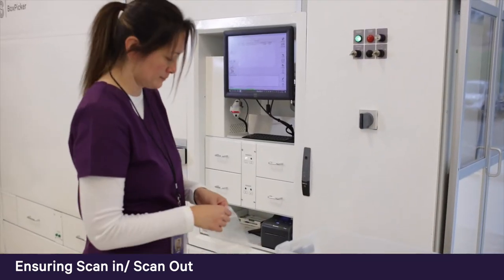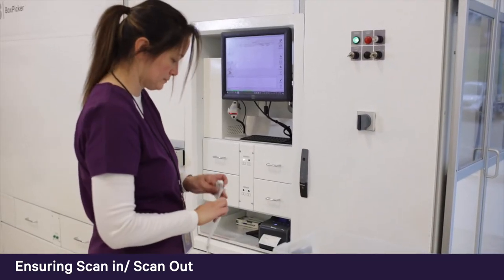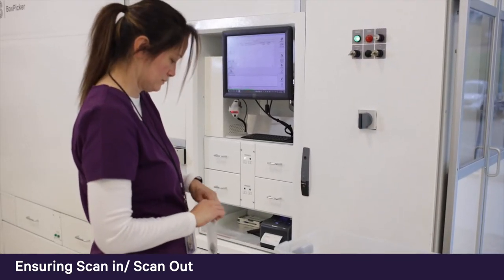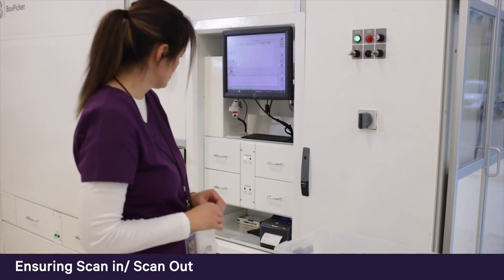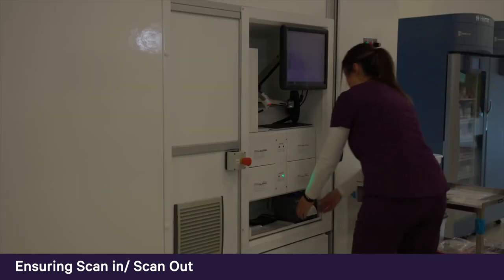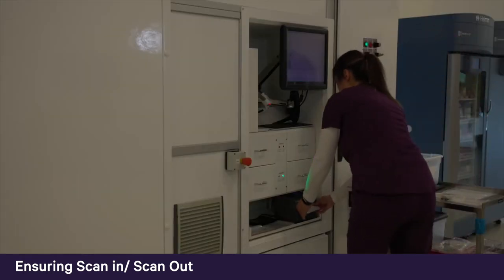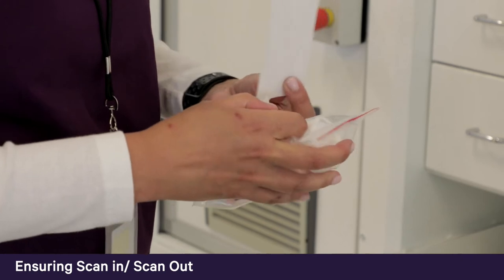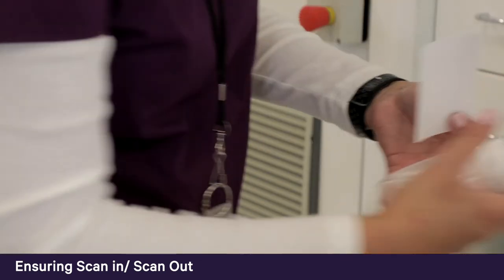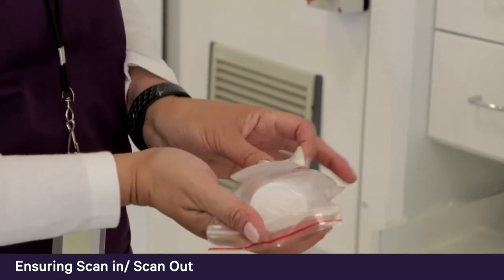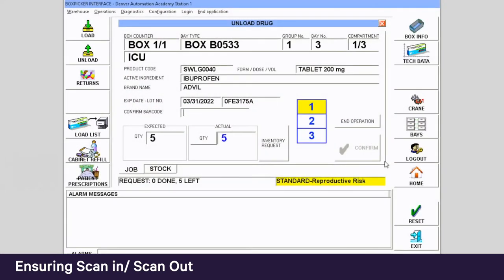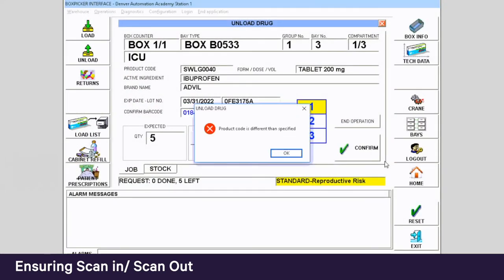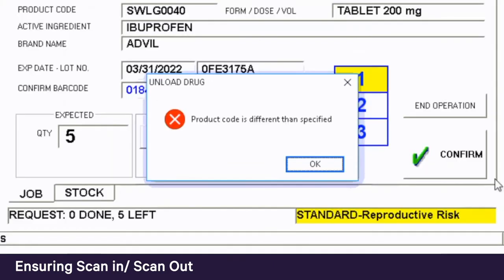The act of confirming the dispense prompts a label to be immediately produced, indicating which patient or cabinet the medication is going to. If the wrong drug is scanned, it will alert the user and not allow them to confirm the pick or produce a label until the correct medication or barcode is scanned.